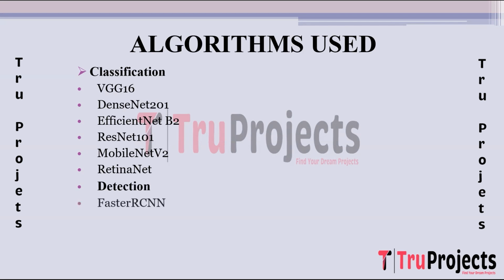In the detection, we have used the following algorithms. Faster RCNN, region-based convolutional neural network. Faster RCNN is a widely used object detection model consisting of two stages, Region Proposal Network, RPN, for generating region proposals and a detection network for object classification and localization.